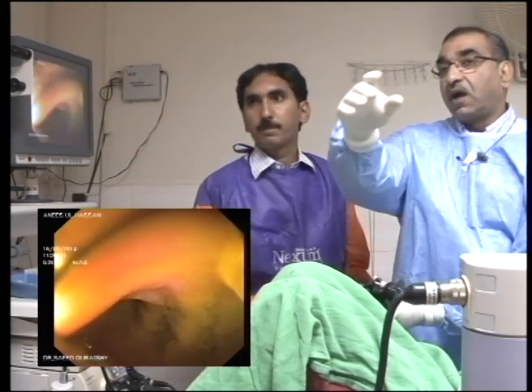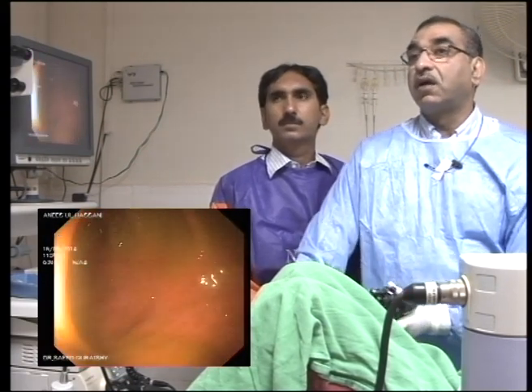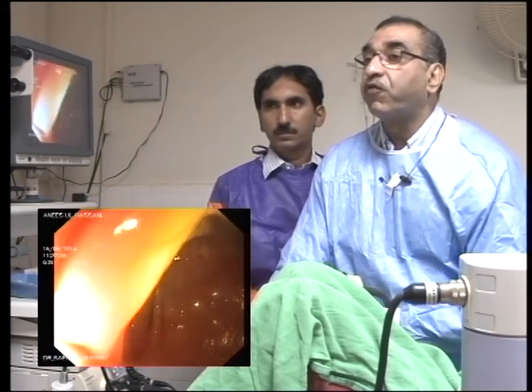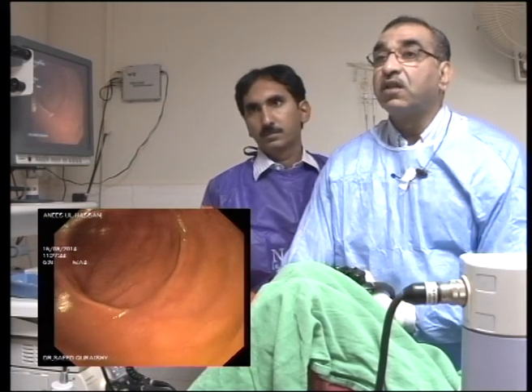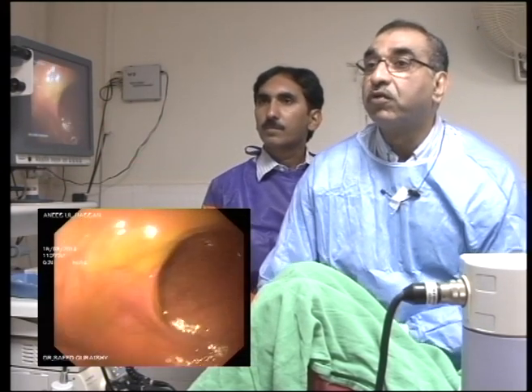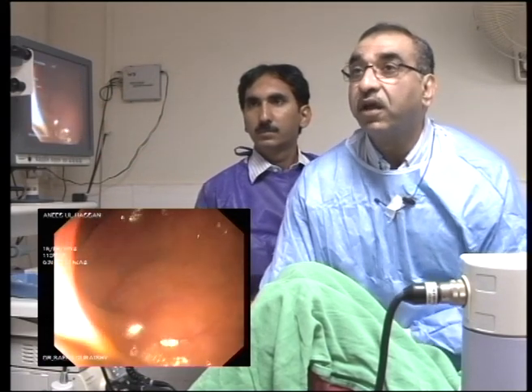So now as this comes, if it's coming from this side, you point out that way. So when you come there, again it's coming towards you, so you do this, see, and then again it's coming in front of your eyes, so you point away from it, and when you point away from it, it wouldn't cover your field of view. So when it's cleared, you go back on it and look on top of it, and again you go back in and look on top of the fold that was going to obscure your view. So the parts of mucosa which you've not covered, you cover on looking back at it. Okay, so that's how you do it.